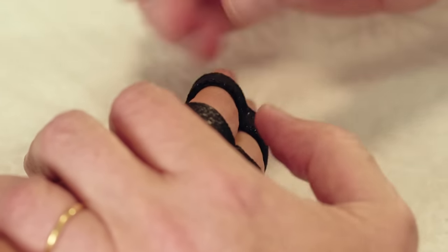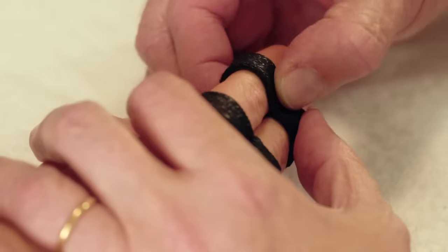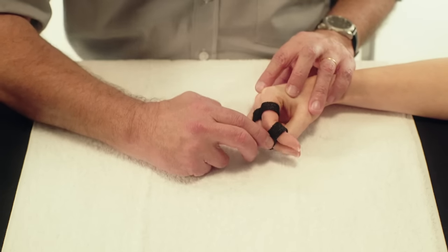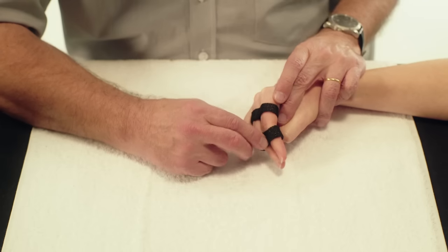The orthosis can be worn immediately after cooling. Monitor the skin between the fingers for rubbing or skin breakdown.